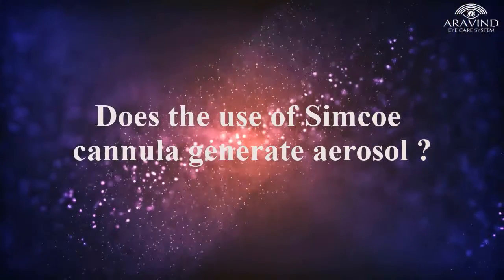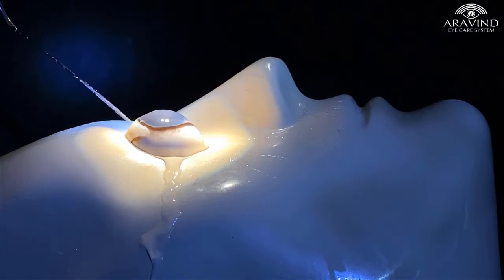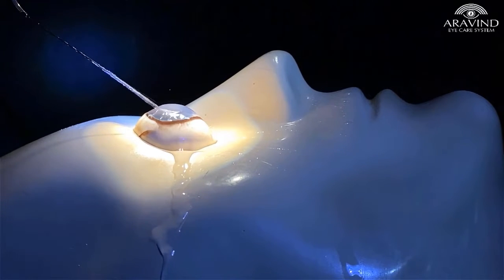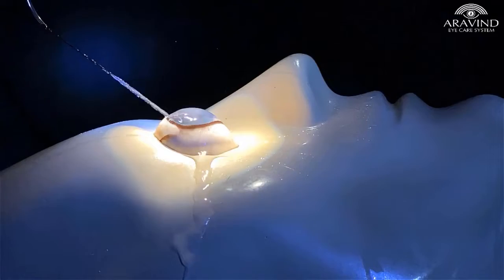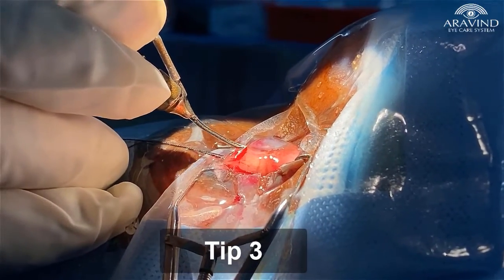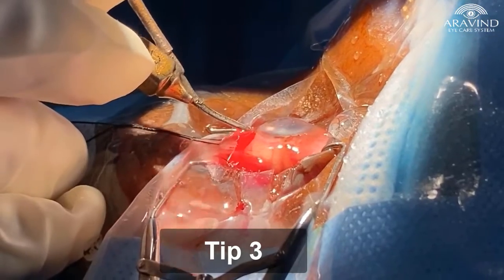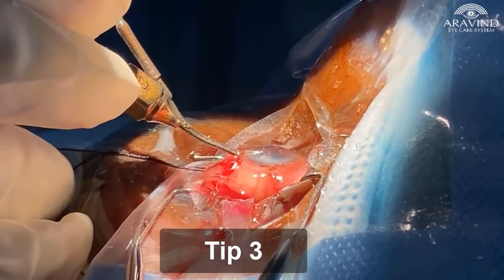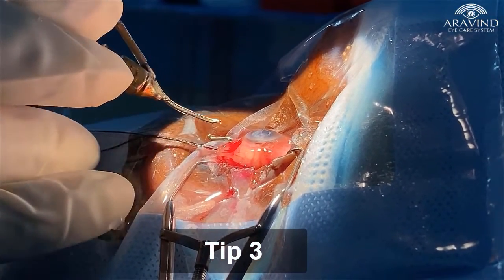Does the use of Simcoe cannula generate aerosol? When the irrigation from the Simcoe cannula hits uneven surfaces, especially after the conjunctiva is dissected and the tunnel fashioned, it can generate aerosols. Enter the viscoelastic filled eye with the irrigation closed and open the irrigation only after entering the anterior chamber. Also, turn off the irrigation in the Simcoe before exiting the anterior chamber.